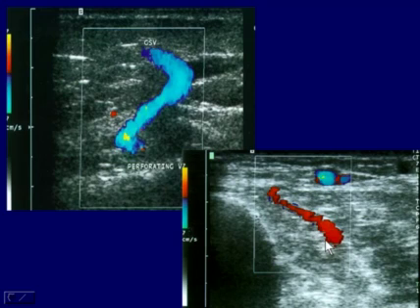We have to be careful because the perforating veins do have a small companion artery, and you can see that flashing at times, and it might confuse you. But again, the veins usually have a lower flow state, more continuous color appearance to them.